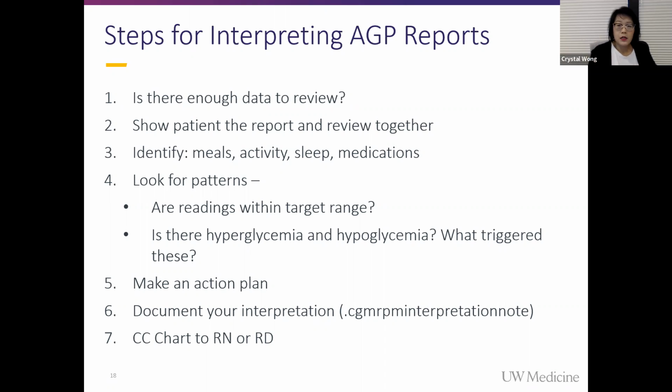report. In a couple slides, there's actually going to be a billing grid that breaks down the different charges and who drops them, when to drop them, et cetera. So I won't get into that now, but that's a good reference. And then after you do your interpretation, please also send this to the RN and RD so they know that you looked at it. They see if there's been any changes that you put into place.